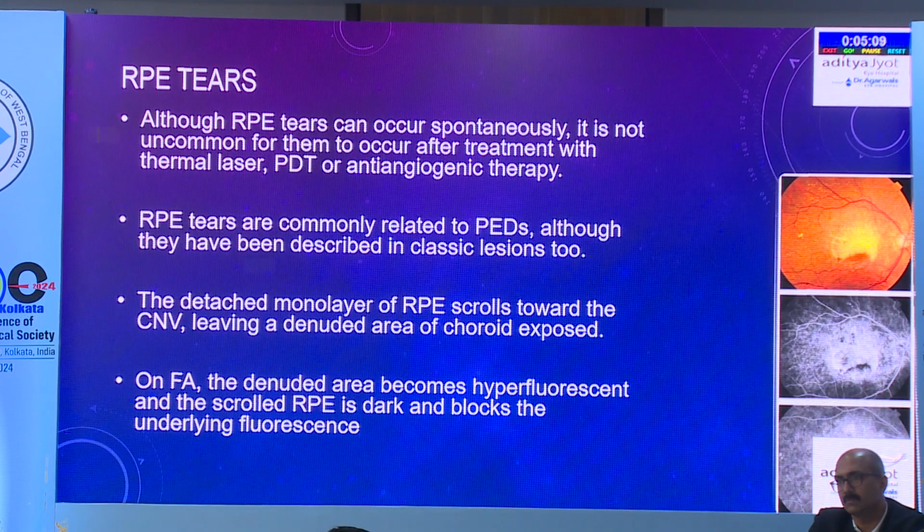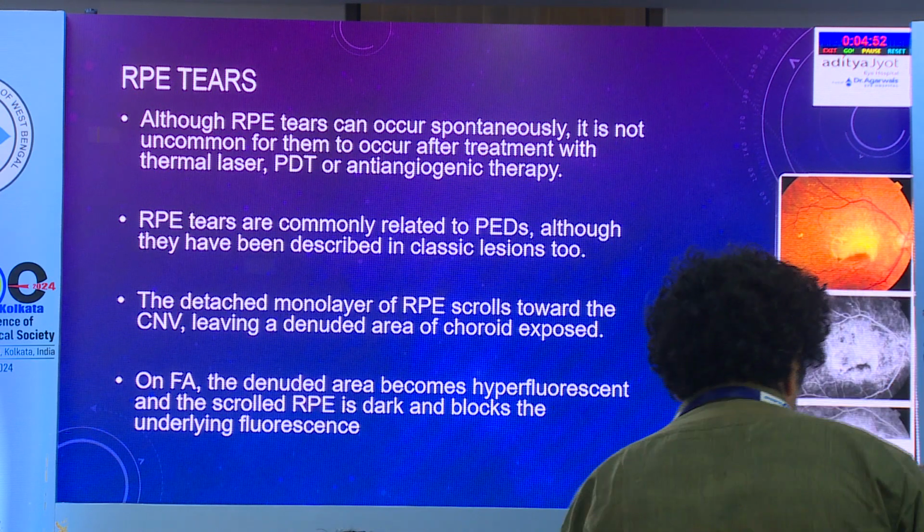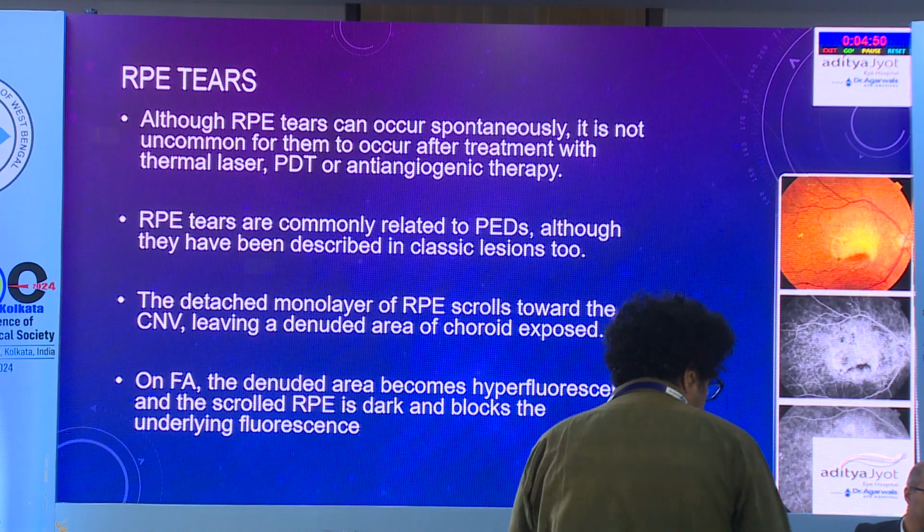Although RPE tears can occur spontaneously, it is not uncommon for them to occur after treatment with thermal laser, PDT, or anti-angiogenic therapy. So this is where the complication, when a patient asks, is there any complication, we have to tell them upfront. And RPE tears are commonly related to PEDs, although they have been described in classic lesions too.